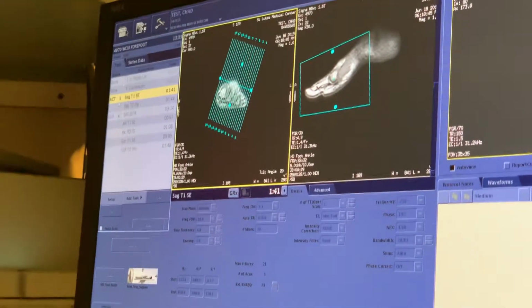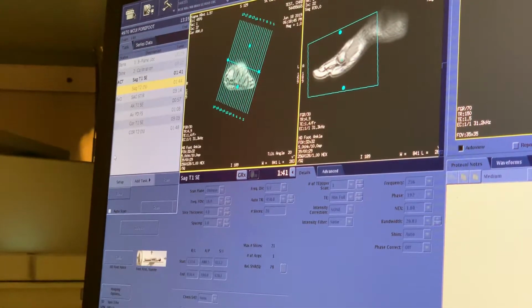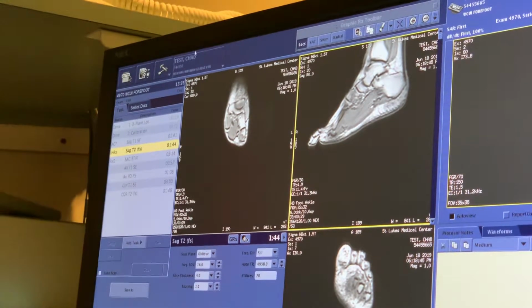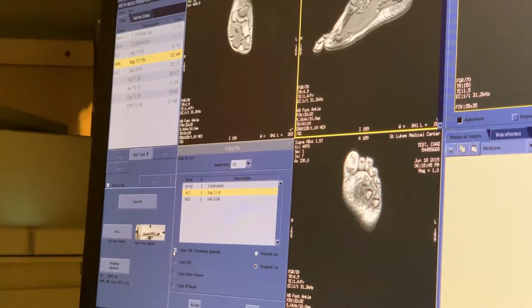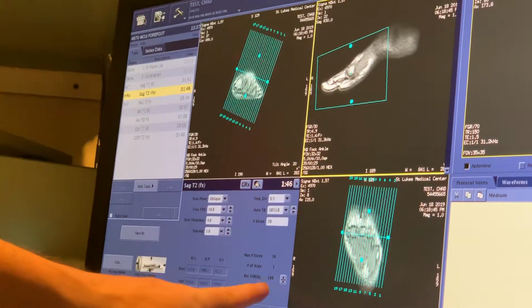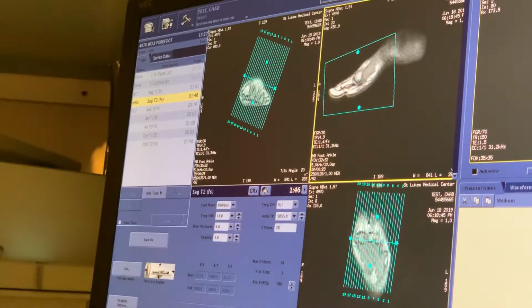What's bizarre here is they've got this T1 linked to the sagittal, and I don't know why they didn't do it to the T2 as well, but you won't have to worry about this protocol where you're going. So we're just going to copy. So I just go to the copy, and I want to pick this one, and it should be the same slice thickness, so I'm going to leave that alone. And you can tell that it was the same slice thickness because the signal to noise is still 100. So if it was a thinner slice, then the signal to noise ratio would drop, right? If it was a thicker slice, it would.